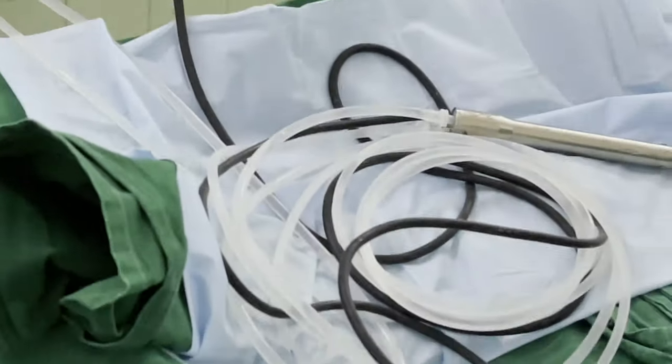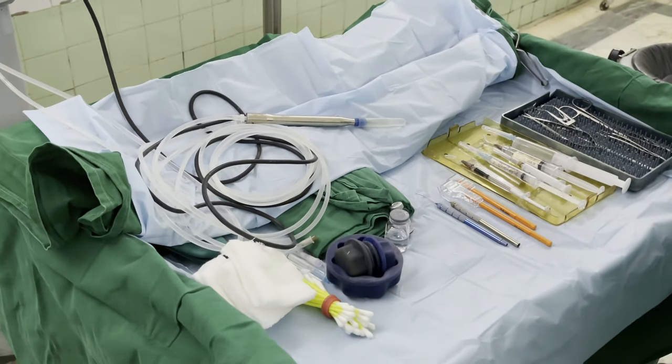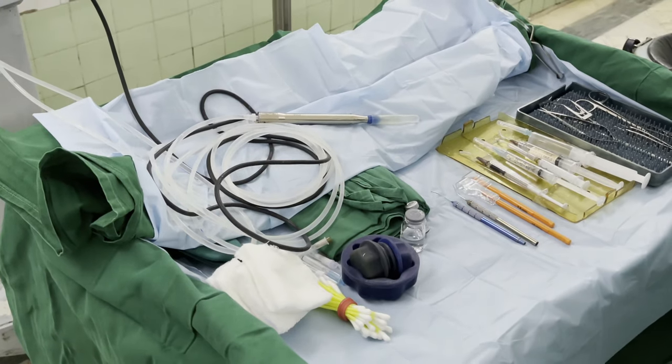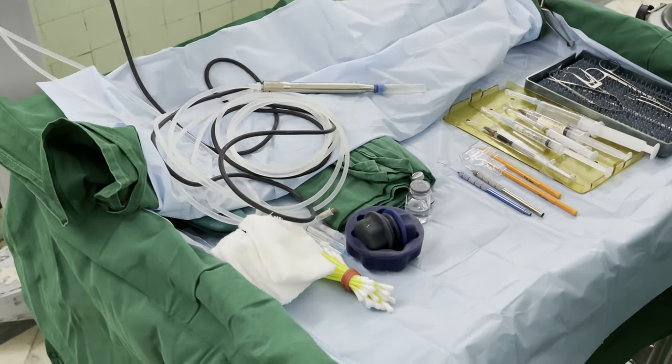I'd like to just note that the entire trolley we do not change in every case, but we keep the base sheet the same. We just keep changing the IV set. All the disposables are new, as well as the head towels. Everything else is new, but the trolley largely stays the same.